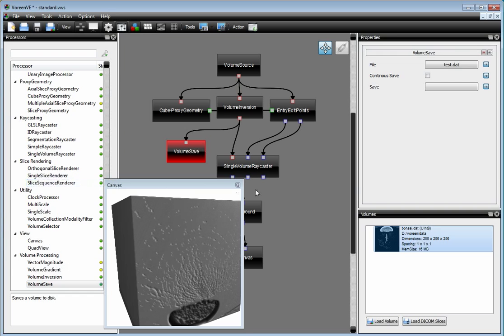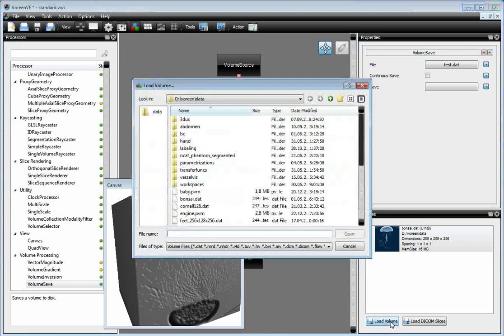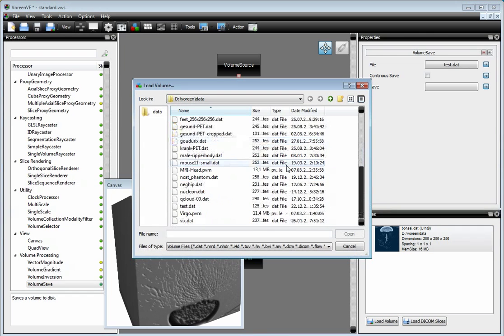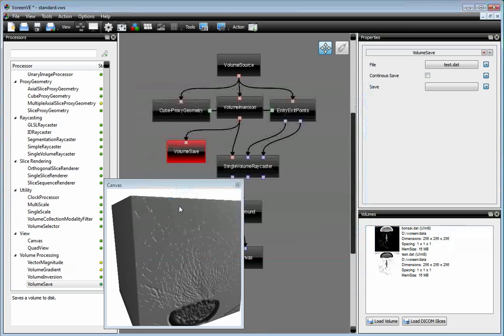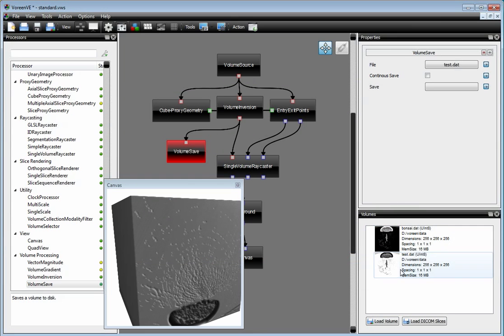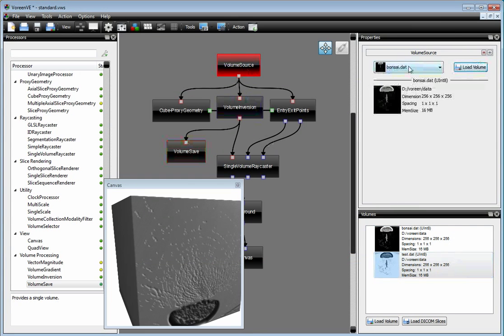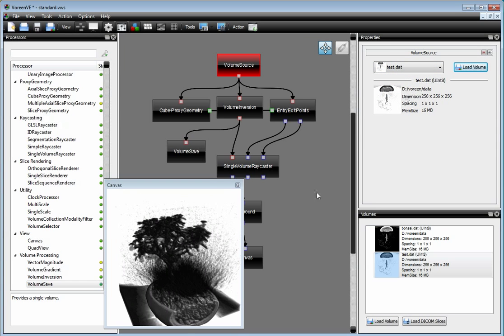Now we have created a copy of this dataset, which is inverted, and of course we can load it again. This was named test. And now you can see we have the inverted copy of the dataset in here. And if we put it again here and we have the inversion, we should come up with the final render.